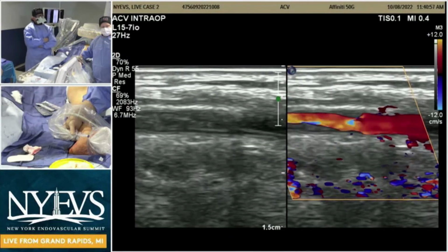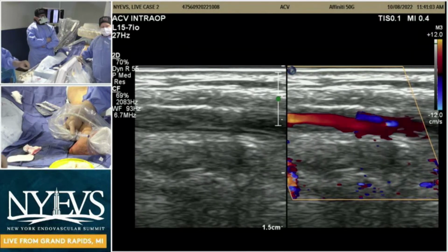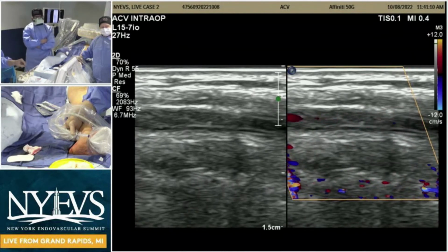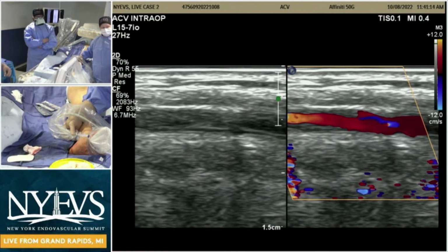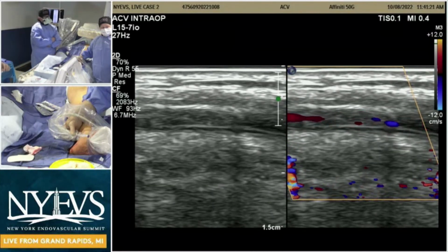No, that's a great question. And you ask the question and there is no answer. There is no data that shows that physiologic result. One thing that I have pushed Philips very hard on is developing, so the chromaflow system gives an indirect measurement of flow. Why not try and standardize that approach, and then look at the various levels of intensity of that chromaflow signal, and say, can you correlate that with the amount of flow that you're getting to a particular area?